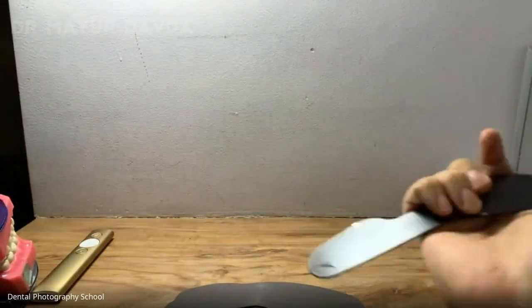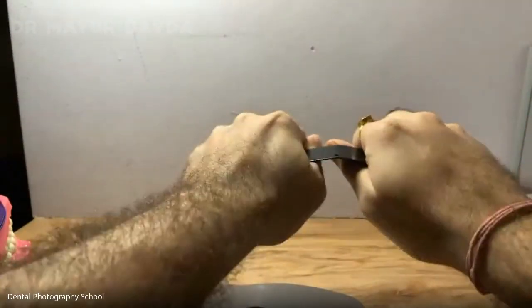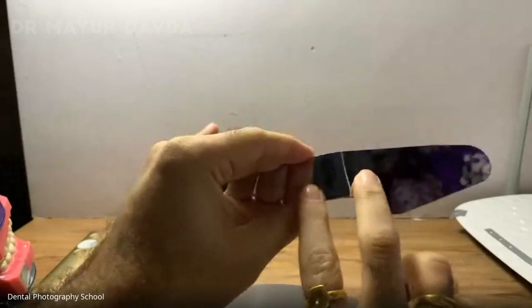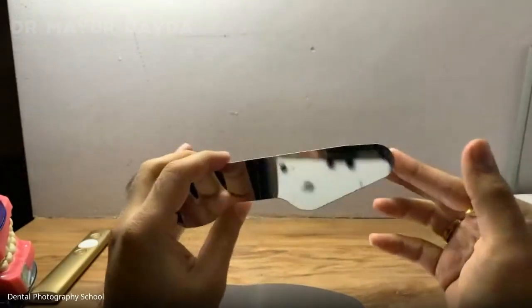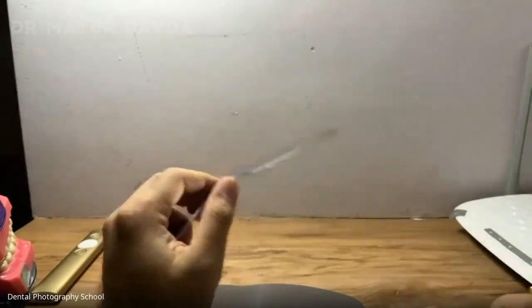Let's see the other one. Even this is contra-angled, and you should not be able to bend them. Same holds true for mirrors. Your mirror should be rigid like this, and you should not be able to bend them. These are extremely heavy duty mirrors, but this 1 inch of the mirror is not the usable part. You have to use this part only or this part only. This is called the quadrant mirror. It is the workhorse for us in dental photography, especially in pediatric patients.